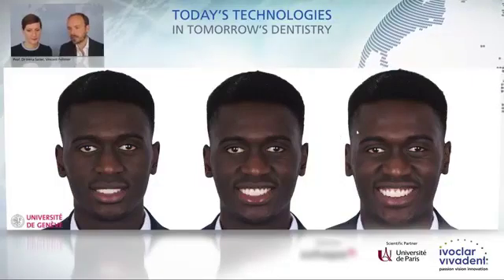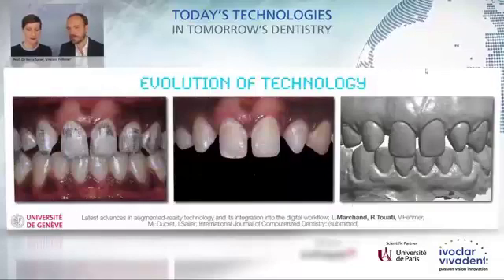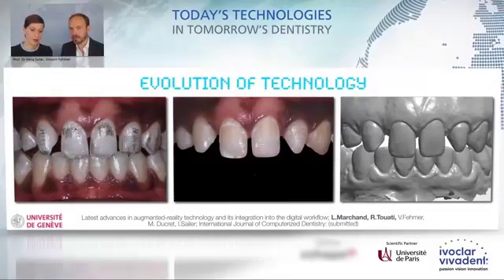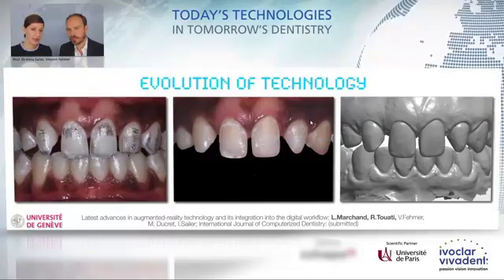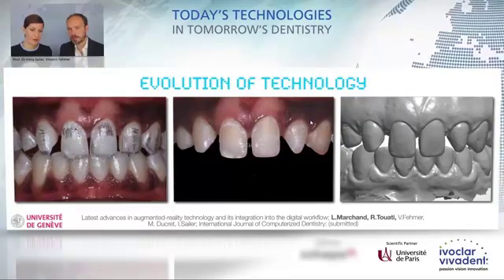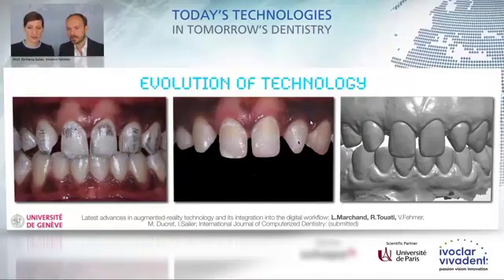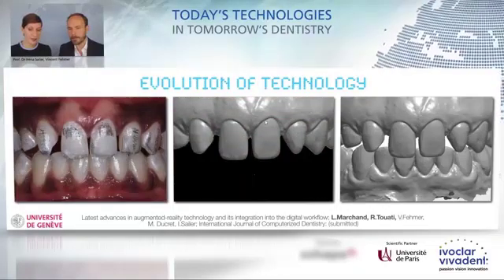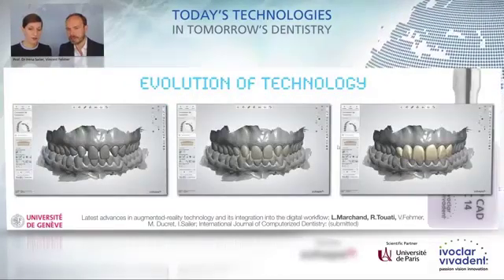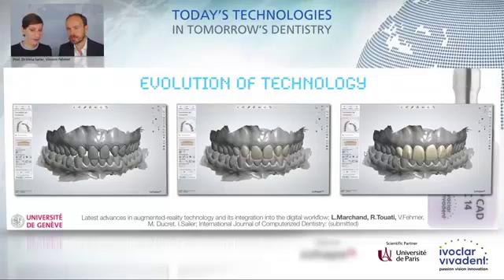It's just a copy-paste to the final prosthesis, which is basically an absolute minimal invasive preparation. Yeah, almost no preparation. You see just a little bit where the markings have been made, a little bit of flattening was performed. Some composite was reduced. Exactly, a little bit of smoothing. And then this situation can be, again, captured by an intraoral optical scan to then be finalized within the CAD/CAM workflow with the respective restorations by copy-pasting these files out of ceramic blocks.